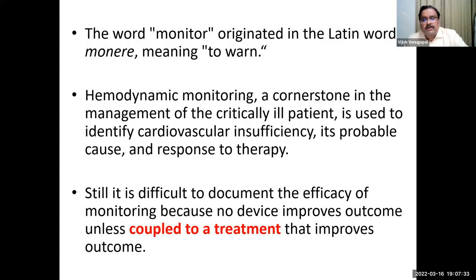So hemodynamic monitoring, which is a cornerstone in the management of the critically ill patient, is used to identify cardiovascular insufficiency, its probable cause and response to therapy. So this is the most important thing. It is difficult to document the efficacy of monitoring because no device improves outcome unless it is coupled to a treatment that improves the outcome.